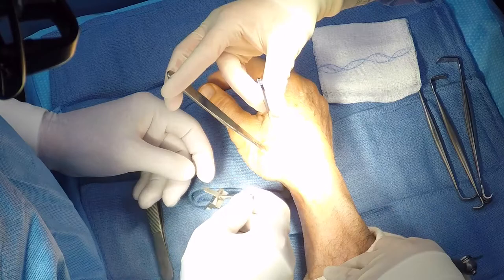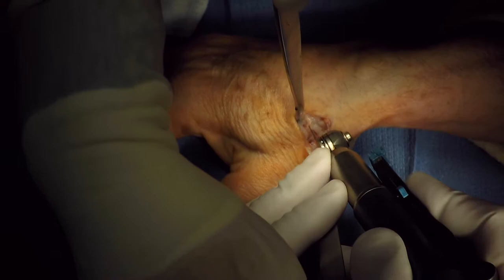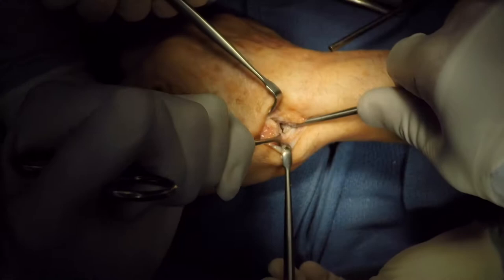A cutting guide is used to fashion between a 10 and 15 degree back cut in the sagittal plane. However, through a small incision, this is used more as a guide. The base will now be removed with the osteotome, and it will be approximately a six millimeter resection of bone.